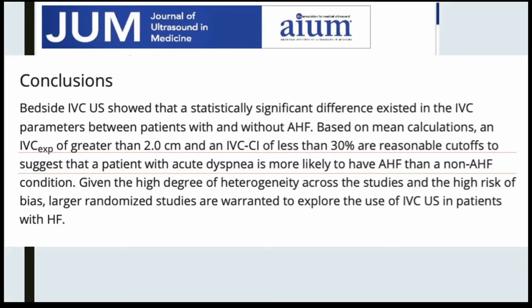in January 2020, people were thinking, if there is bad evidence for showing your fluid status, and it shows the right atrial pressure, what if we use it for showing who's in heart failure? And I think, where we are on fluid status, this study done in January 2020 said, well, if the IVC is big, we were probably looking at people with bad hearts for acute dyspnea and not just fluid status. And that might be where we are going in the future for fluid status.